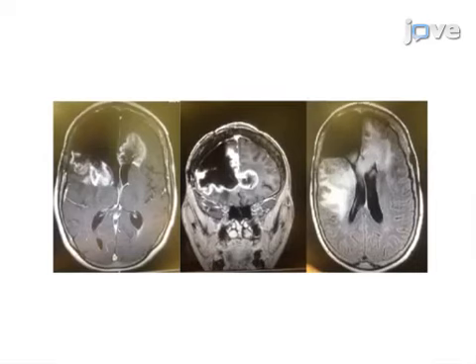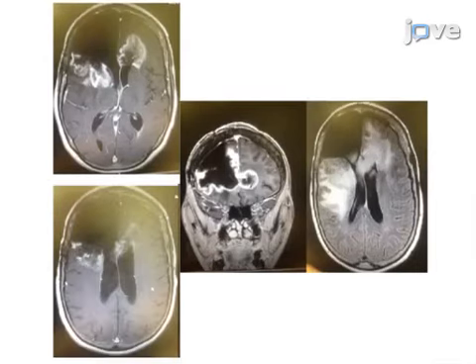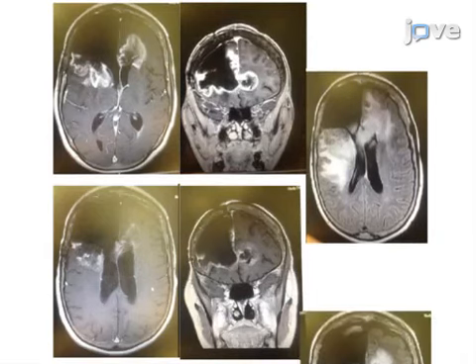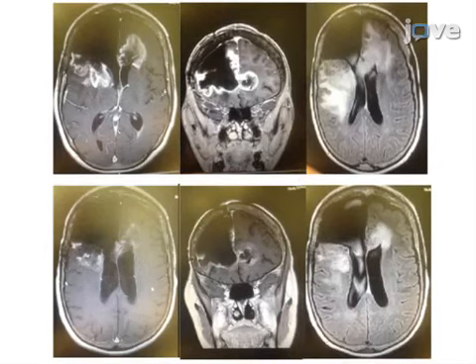Ultimately, a follow-up MRI of the brain with gadolinium DTPA is obtained in order to assess tumor response to this novel therapy. Though this method can provide insight into the treatment-resistant gliomas, it can also be applied, in theory, to other tumors, such as brain metastases, although currently the only FDA-approved indication for TTFields is for recurrent glioblastomas.